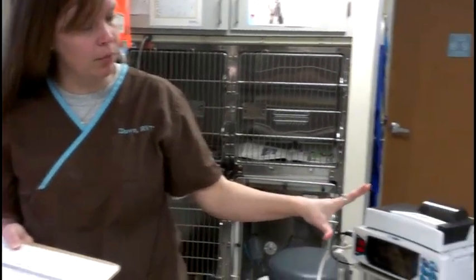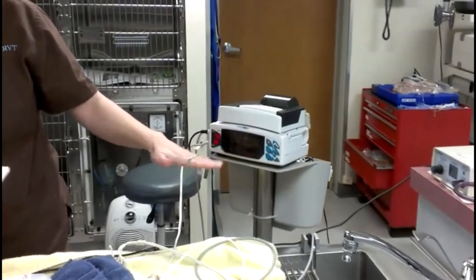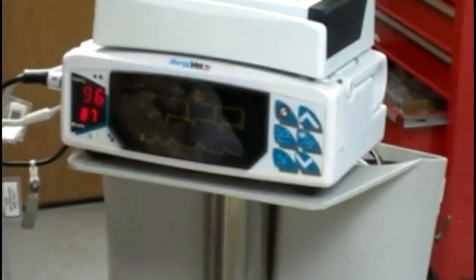I'm assisting Dawna with her dental today, and I am monitoring anesthesia for her patient. It's very important that we keep an eye on them throughout the procedure and manage several different parameters, just like they would do to a person in the hospital. So I have our anesthetic record where I'm writing down various factors, one being her ECG or her heart rate. I'm monitoring the waves, making sure there's no arrhythmias, and the number is good. 87 is a good heart rate under anesthesia.